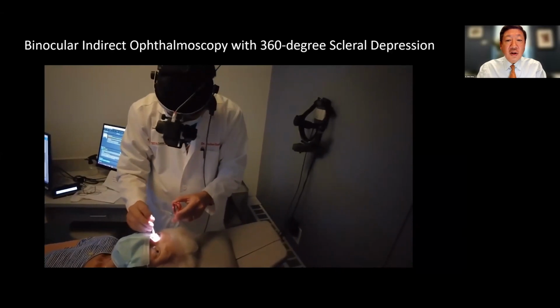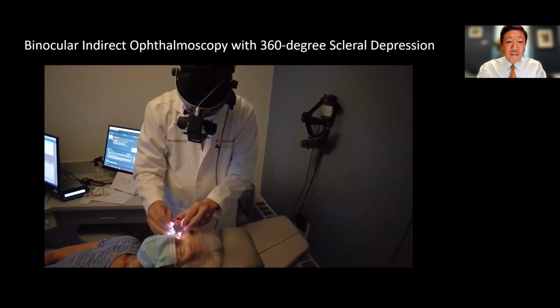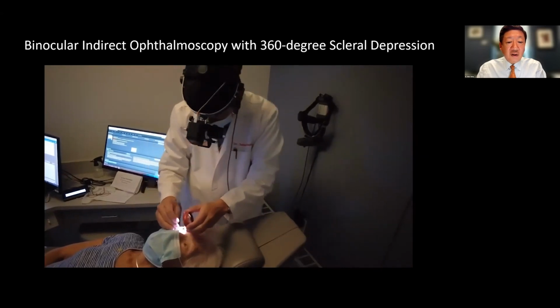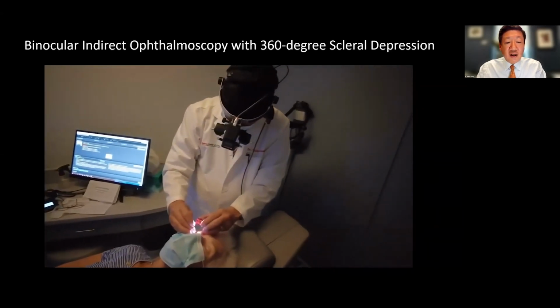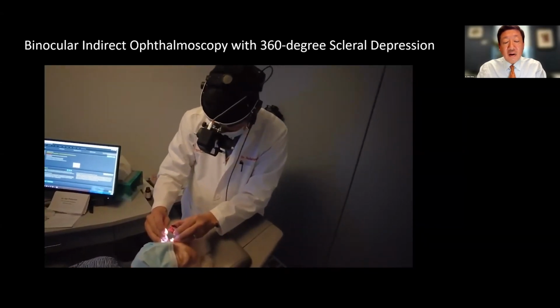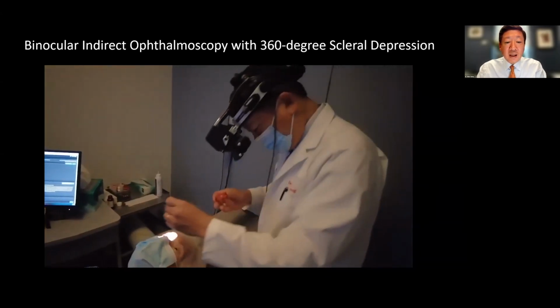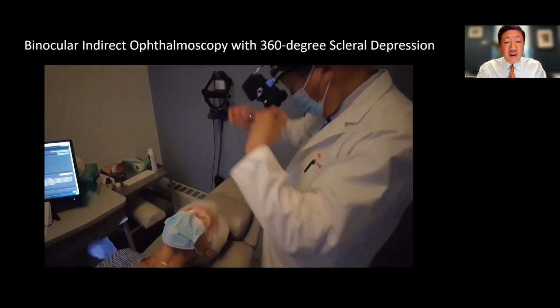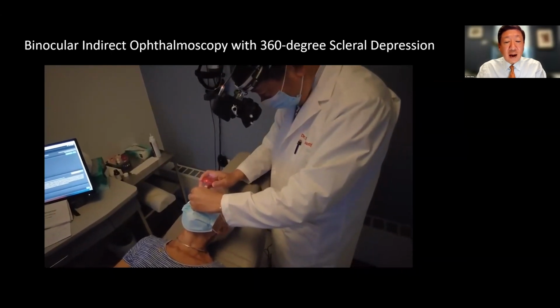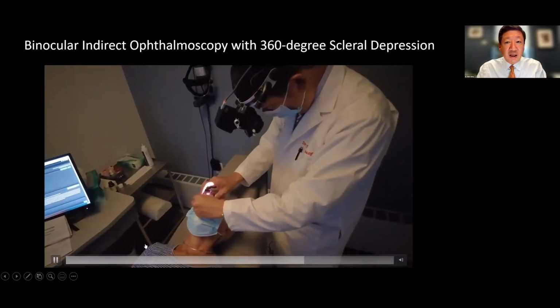And then I'm switching hands to look at 4 o'clock and 5 o'clock. And often if you tilt your head a little bit, you can get a better view in difficult areas. This person is very, very cooperative. You just see, I asked her to put her chin up, and here she's looking down in the direction of the depressor, so we can see the anterior part of the eye. I shift around the chair, and I resume where I left off. So I overlap at the 6 o'clock position, and then move around the eye to complete the examination.